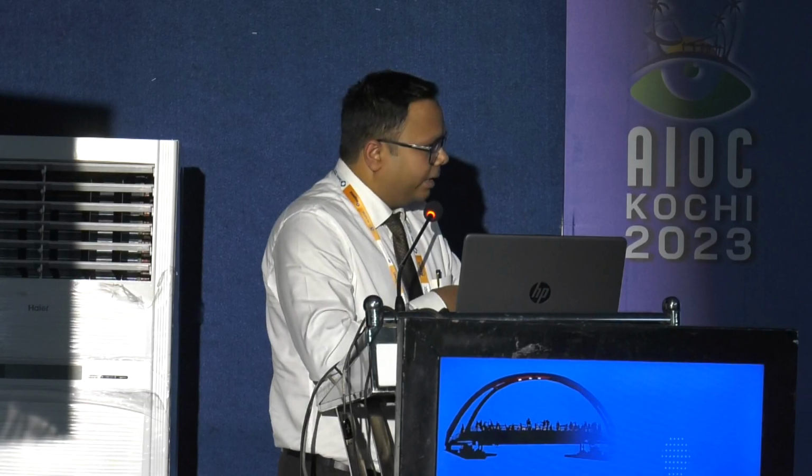Forceps can be tried, but as also shown by Dr. Soman Mandal sir, at times when you are using a PFCL, these flaps, this retinal flap or an ILM flap, might float onto the PFCL. That becomes extremely difficult to reposition again. So what I have done in this case, and I will do again if needed, is that after generating this flap, I drag it very gently below the PFCL to the hole.